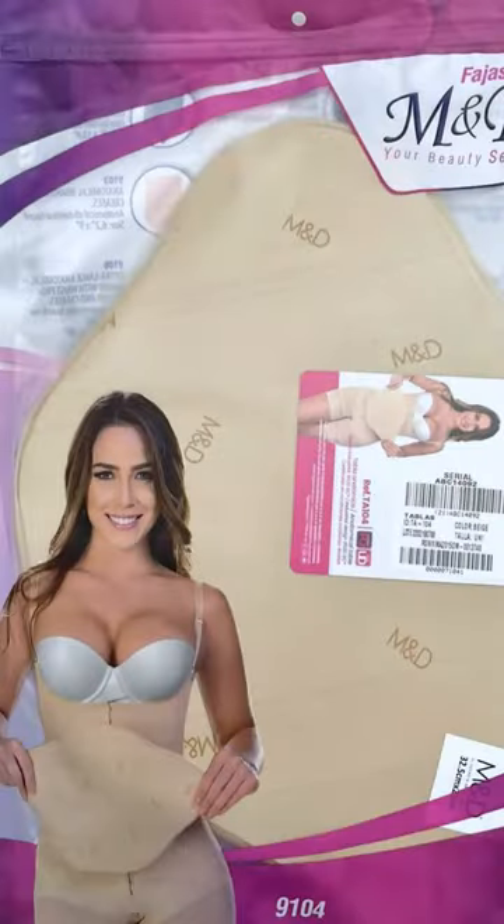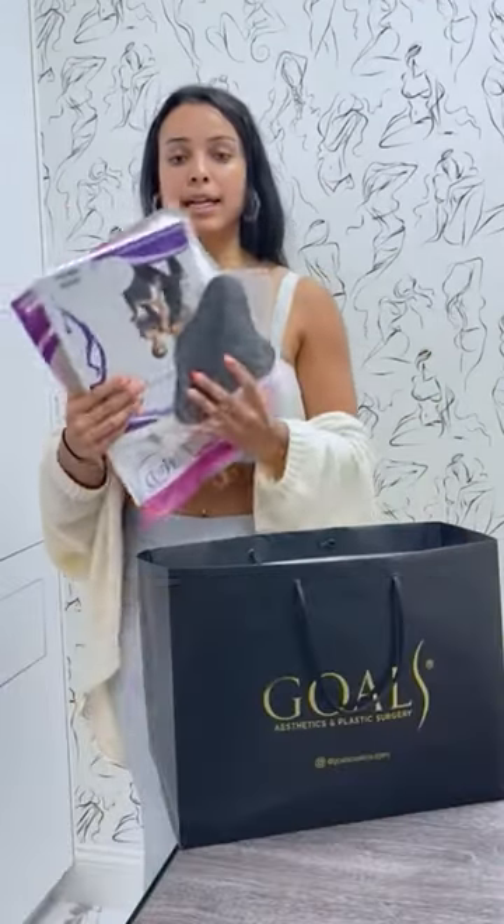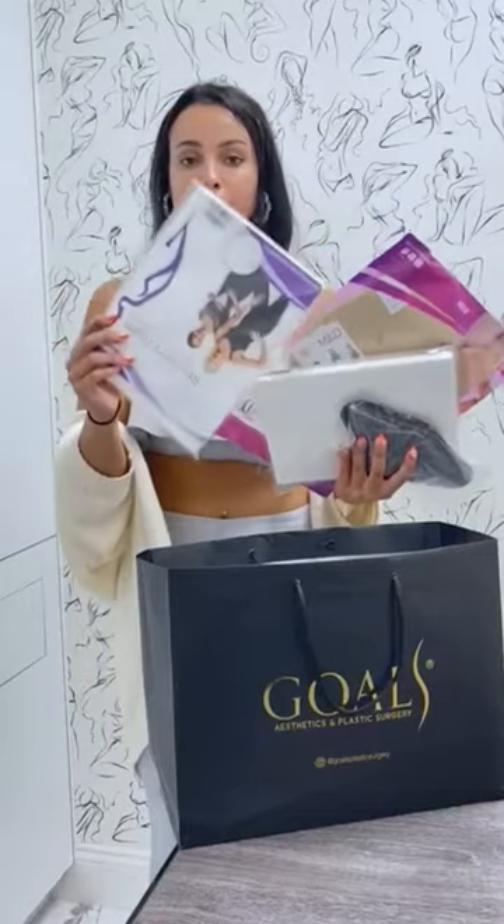Now you'll also get a couple of boards. You'll get an abdominal board, recovery foam boards, and also a backboard. These will all help with extra tightness and also help get rid of that extra swelling you may have and help to get you your figure. The recovery foam board will also help reduce bruising.